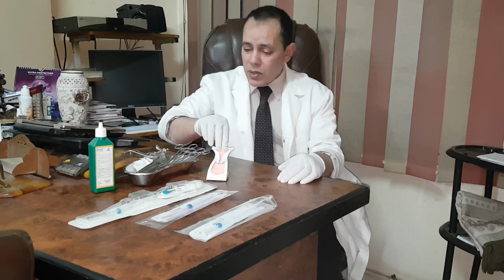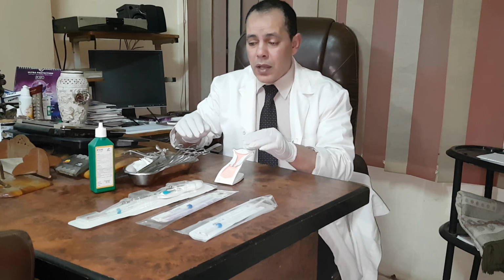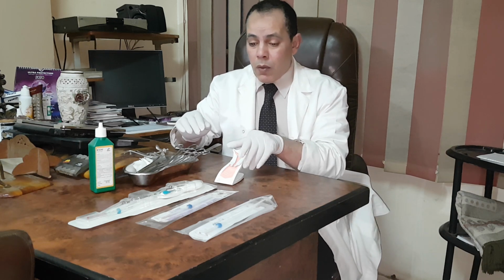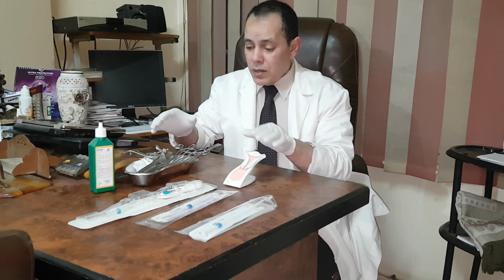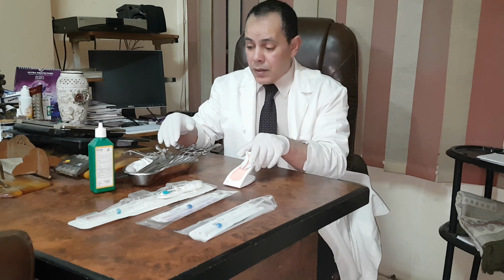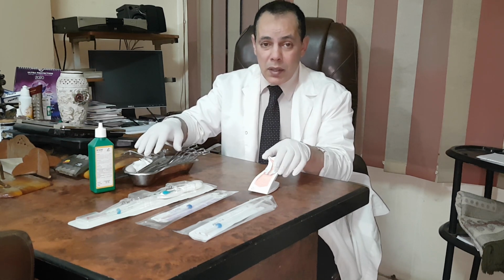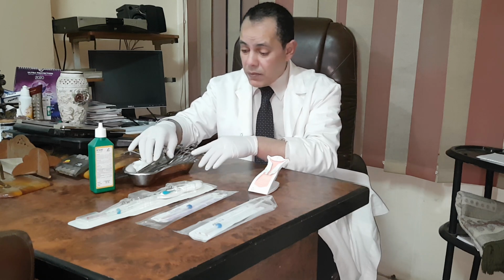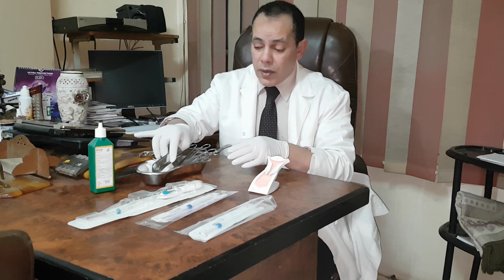Today I wanted to discuss with you an important topic, which is IUD insertion. What are the types of IUDs and what are the instruments needed to insert an IUD? All of us know that the IUD is a very common contraceptive method and is used in different countries all over the world.